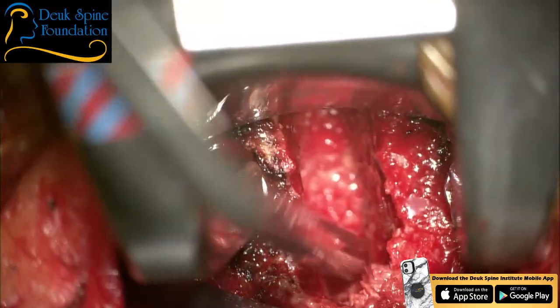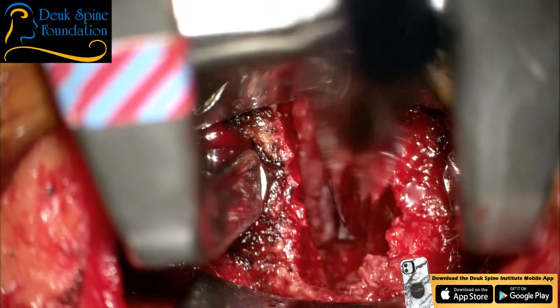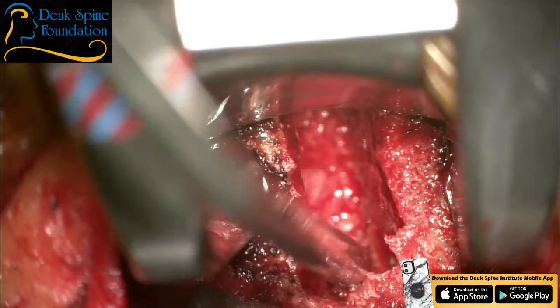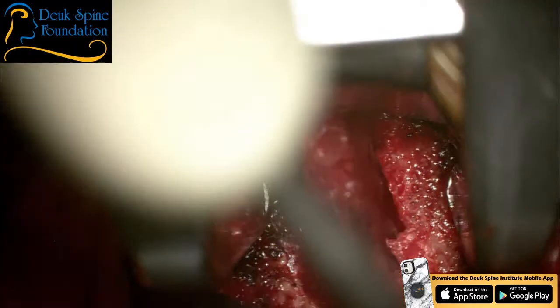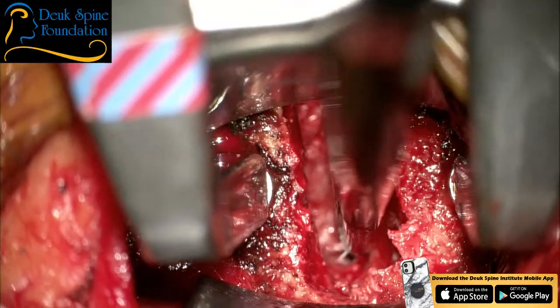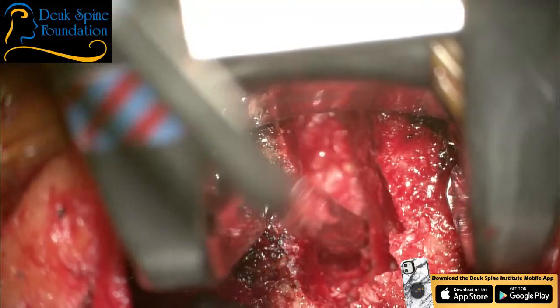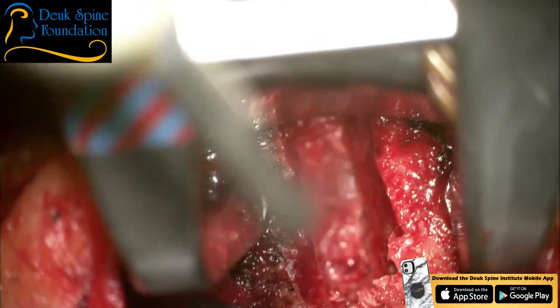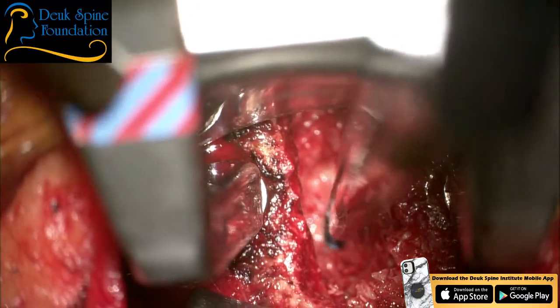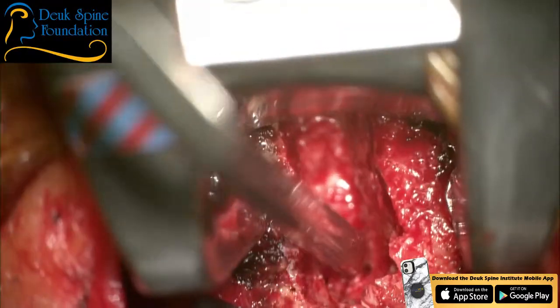Did you not find a smaller sucker? I mean, isn't that a 9, Luis? Wipe, please. Isn't that a 9 you gave him? There should be a 7 on the field. Yeah, this is a 9. That's what he's got. He needs a 7. We used to always have a 7 in a set. Wow, look at that. Let me have a little bit bigger.